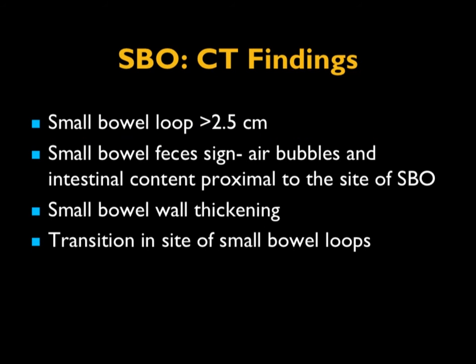When looking at bowel loops, small bowel loops over 2.5 centimeters are considered dilated. We talk about the feces sign — air bubbles and intestinal content proximal to the site of small bowel obstruction — one of my favorite signs when you see it. Small bowel wall thickening is over 3 to 4 millimeters. We talk about transition sites. When you see dilated bowel, look at where it changes — at the transition point, is there a mass like a carcinoma? Is it into a hernia? Into adhesions? CT is very good at answering that.